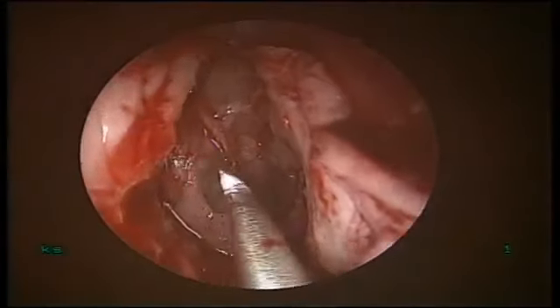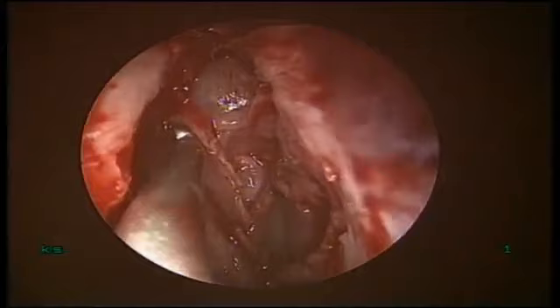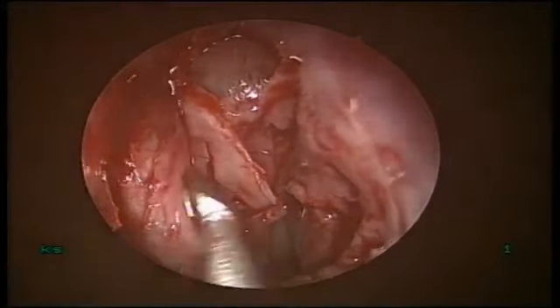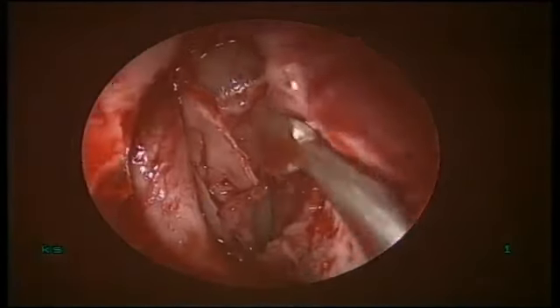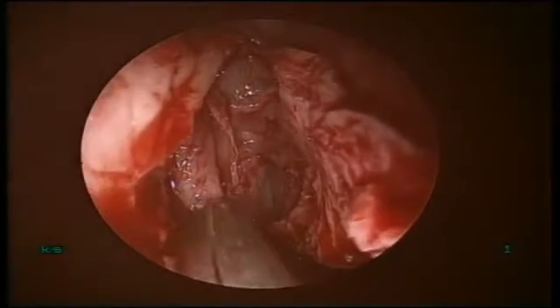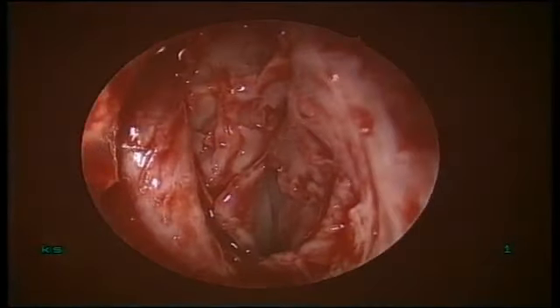Now I will increase the decompression behind as well. See this? So this full circumference of the nasolacrimal duct now is in view. Can you see? Decompress. So I will completely marsupialize this. See like this.